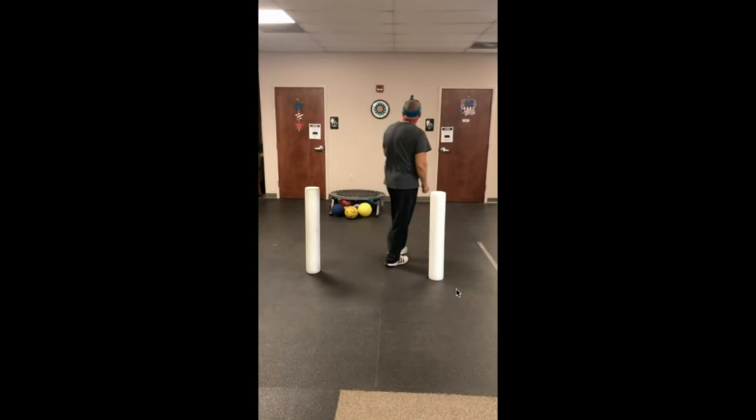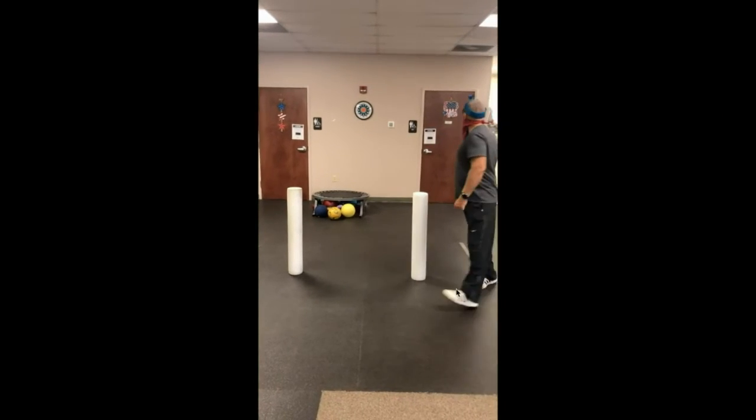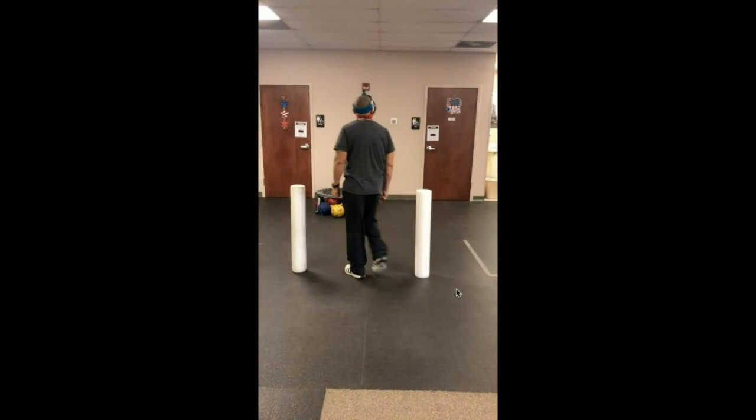Okay, you line that one up very quickly. Get your head faster around. There you go. Get that laser on the target as you come back through.